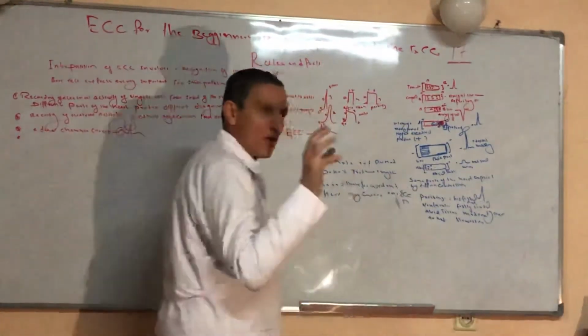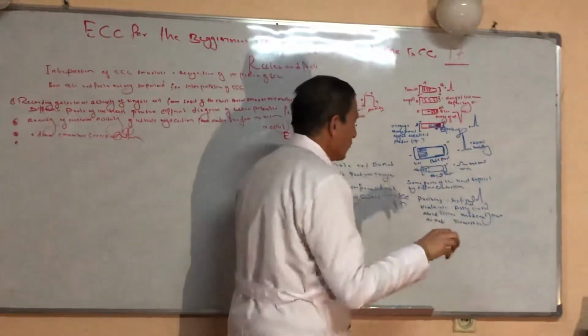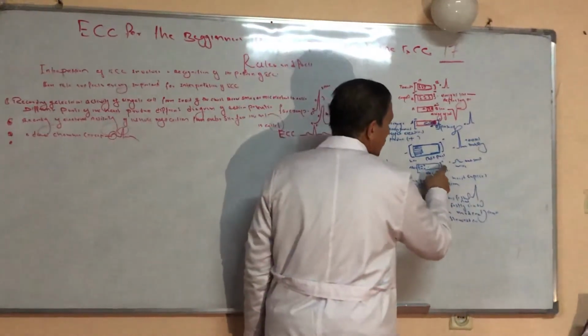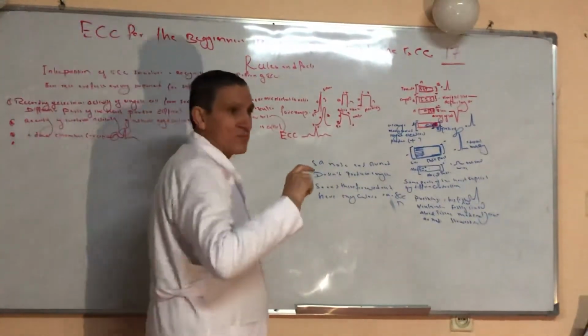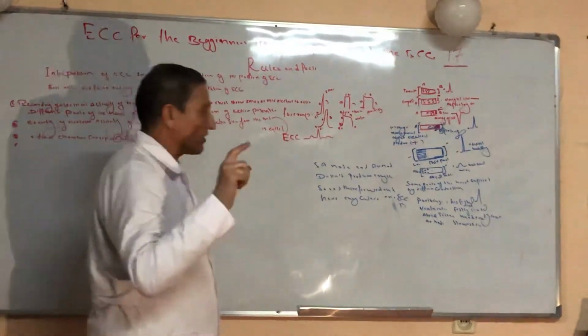Atrial tissue is a small tissue. It is made from fewer cells, and they need less sodium. When electrical activity is produced within the atrial cells and the positive charge goes toward the positive electrode, the deflection in the needle will be positive, but a small deflection. Thicker parts produce large deflections, and small parts produce small deflections.